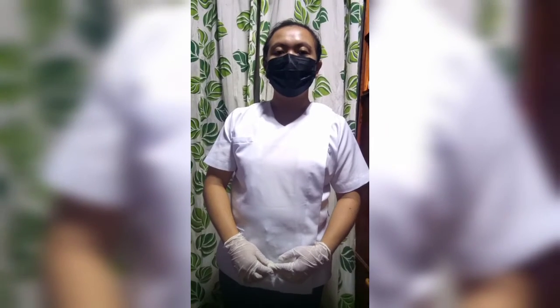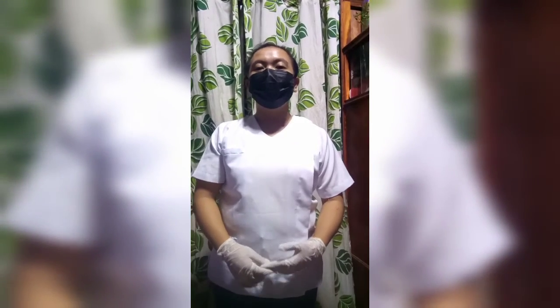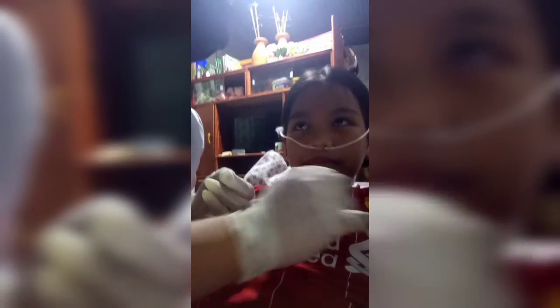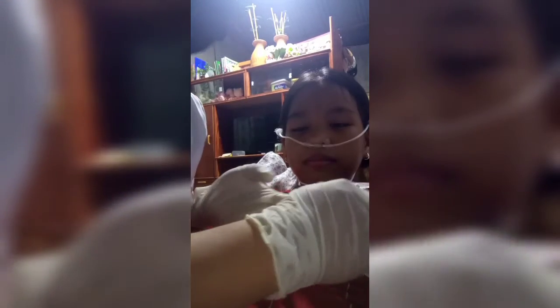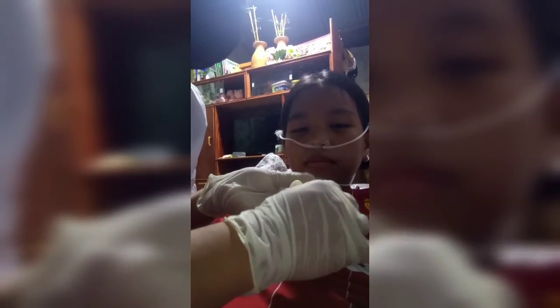Excuse me, ma'am. Adjust the fit of the cannula as necessary. Tubing should be snug but not too tight against the skin.